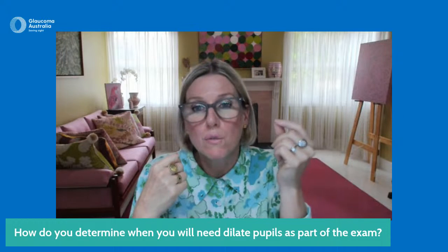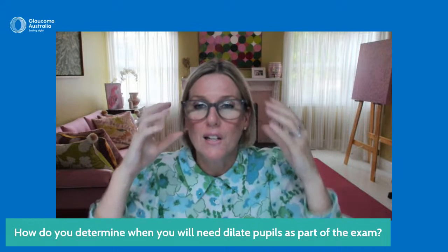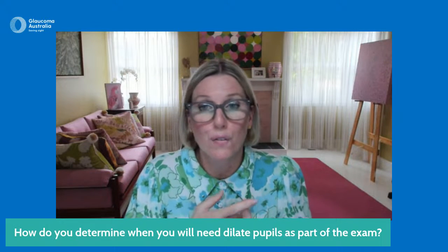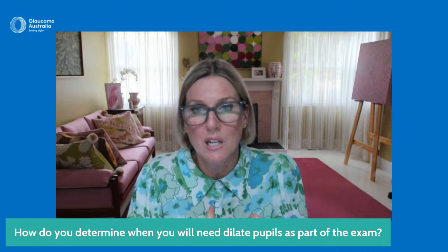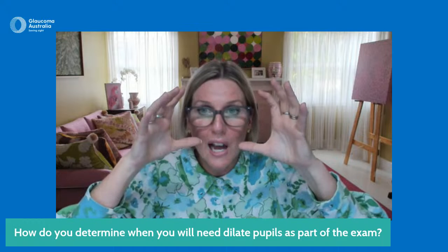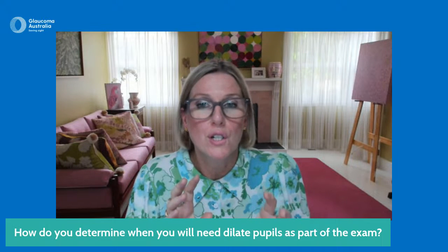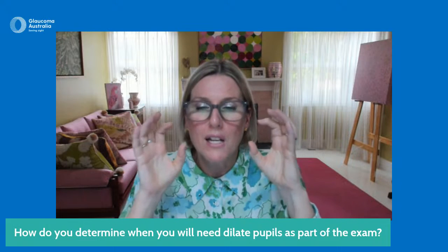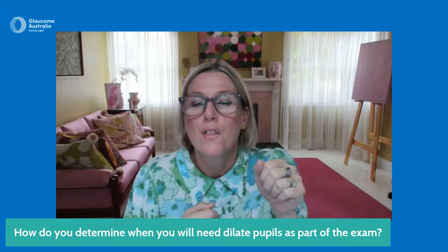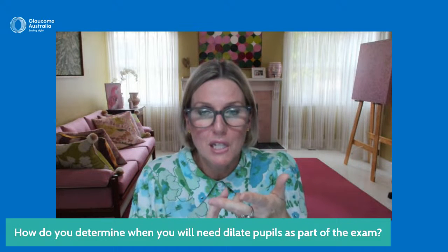So we put the drops in the eyes to make those pupils large, and then that gives the doctor a really good view inside the eyes, and it can help make the fundus photography and the OCT measurements easier as well. So we have drops to make the pupils larger, and we also have drops that stop the child from being able to focus. And when we paralyze their focusing, we can then take a measurement with a special tool that measures for short-sightedness, long-sightedness, and astigmatism.